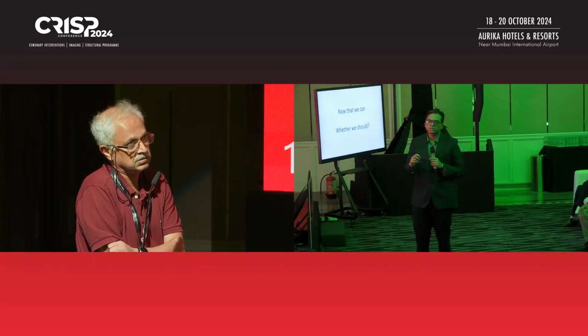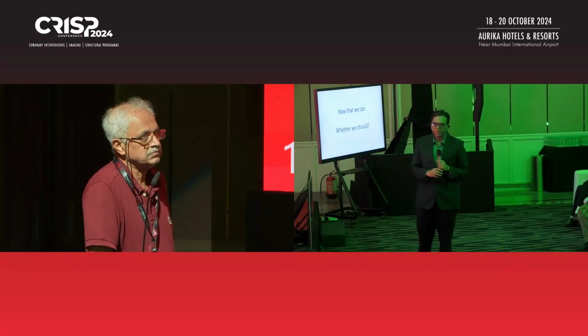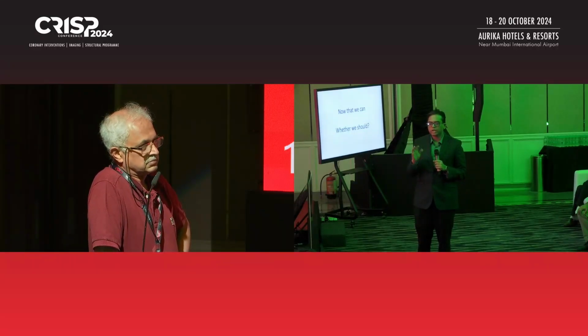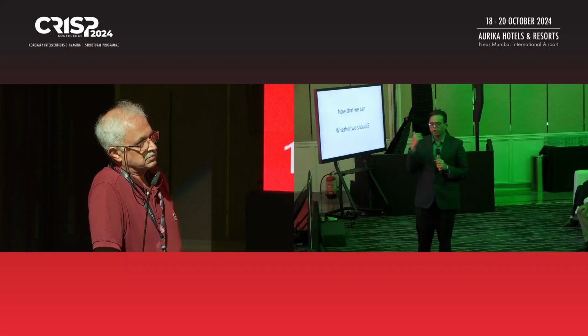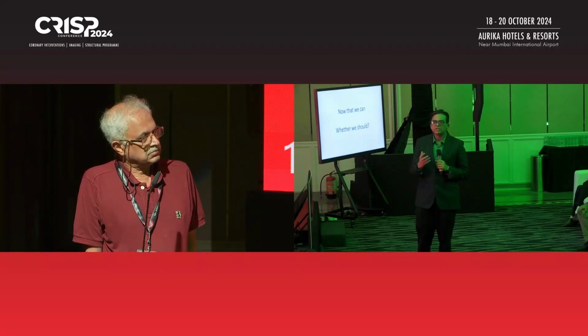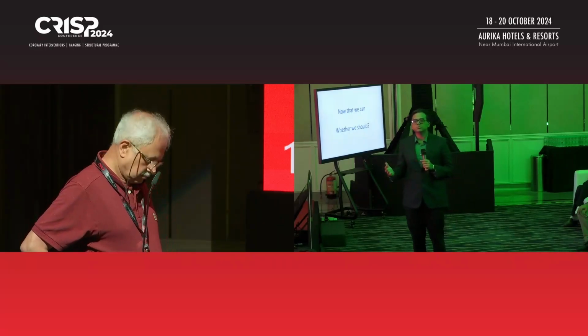So last question, sir. If there is pulmonary hypertension, say in a 50-year-old, a fenestrated device, like for me I have a PVR by SVR of 60, you do a cath study, you find a borderline cath study. A fenestrated device versus, if at all, you send to the surgeon and he does a fenestrated patch, is there a benefit? Does the natural history of the disease change? Or is it just a symptomatic benefit?